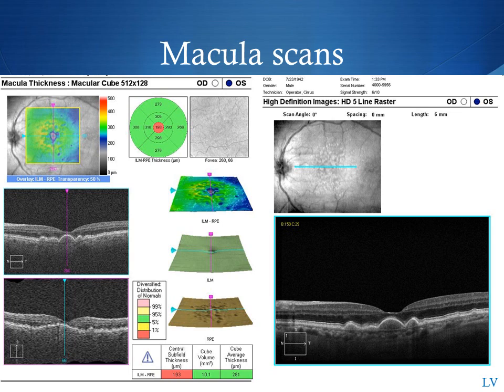I prefer to use the 512x128, because the 512 scans in the horizontal direction gives you higher definition. If there's a lesion that you're interested in, I'll use the 5-line high-definition scans, as you can see on the right-hand side. You can adjust the different angles for the scan and the spacing, and also the length of 3mm, 6mm, or 9mm. When the spacing is set to 0mm, it usually gives you the highest definition.